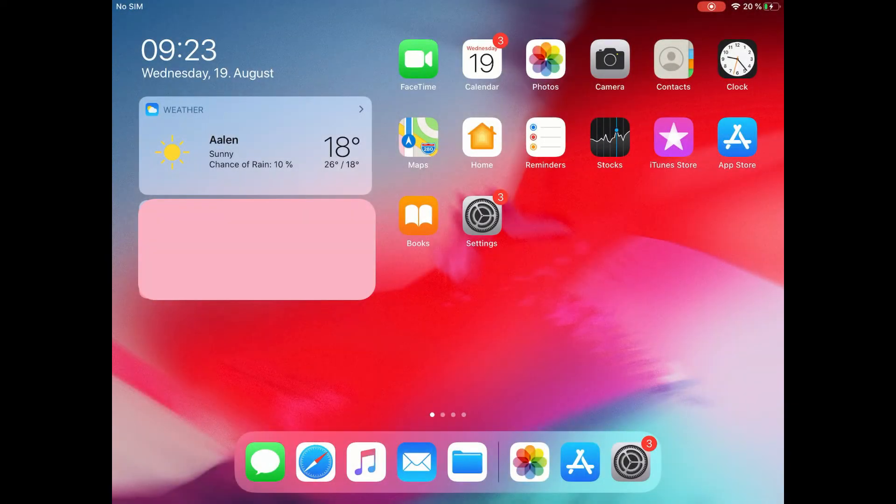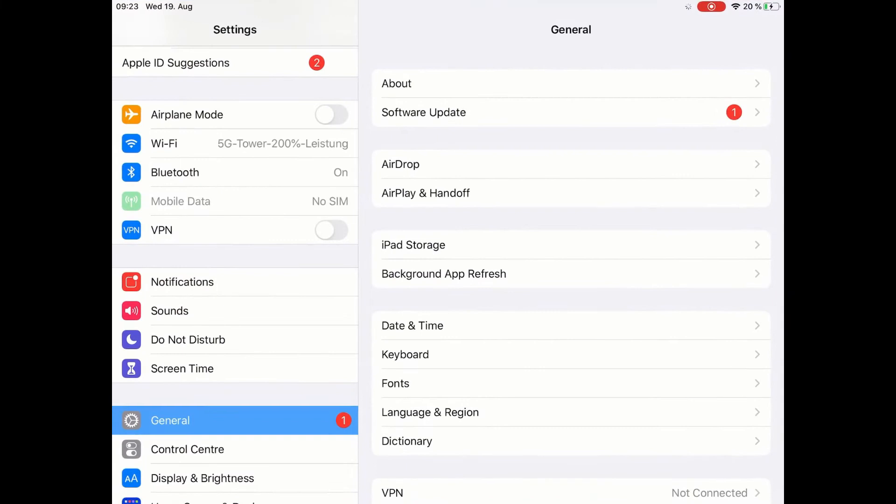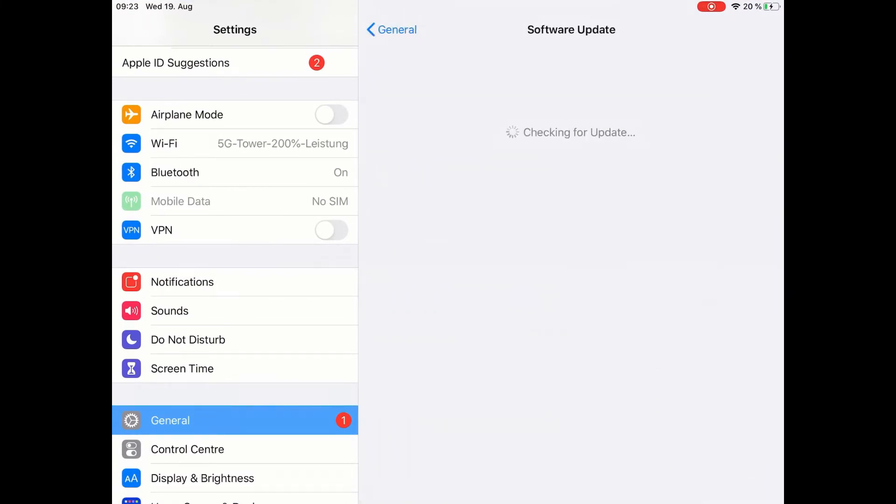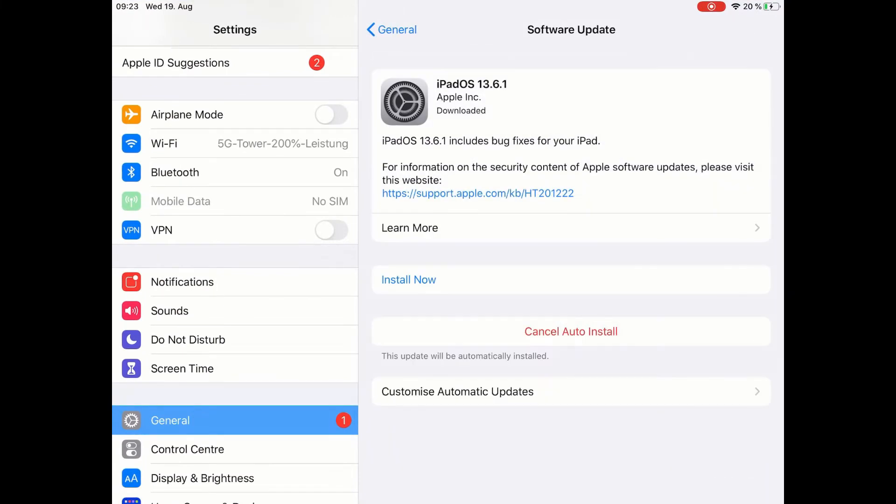Before installing ZEISS Connect for the first time, please check if your iPad has the latest current operating system of iPadOS. This guarantees the latest security standards and the functionality of all apps.